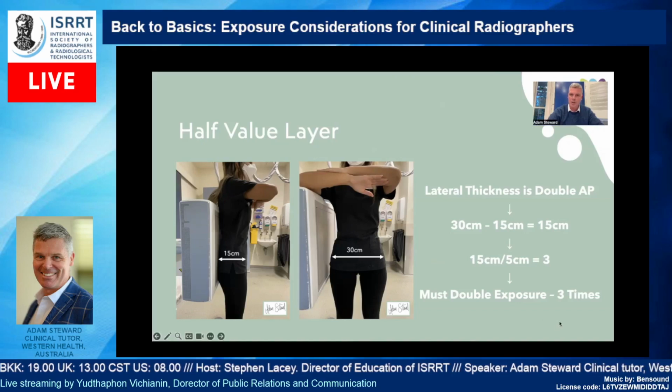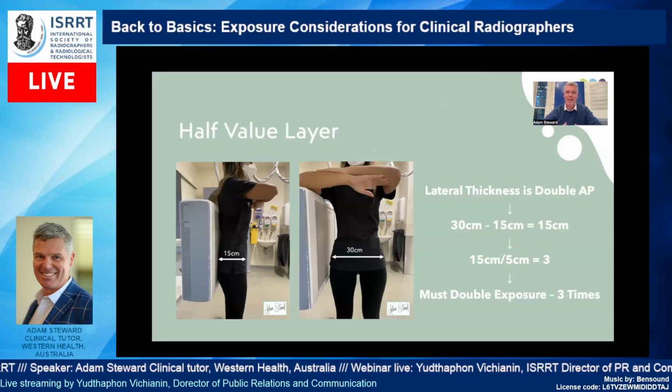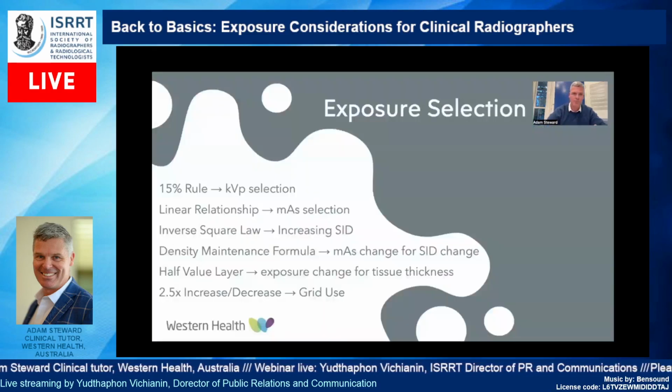Again, take this with a grain of salt and utilize it within your systems, but hopefully this gives you a tool that you can use, and you can start to think about when and how I'm going to adjust my exposure depending on the patient's size, rather than just, well, if they're a bit bigger, I give an extra couple of bits or whatever else. You actually now have a slightly more logical approach as to how you do it. So I hope that can benefit you in that way as well.